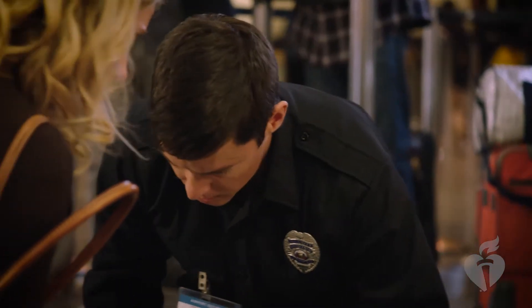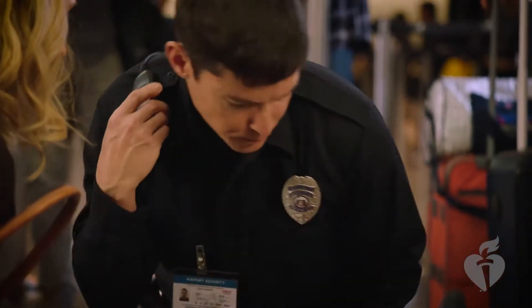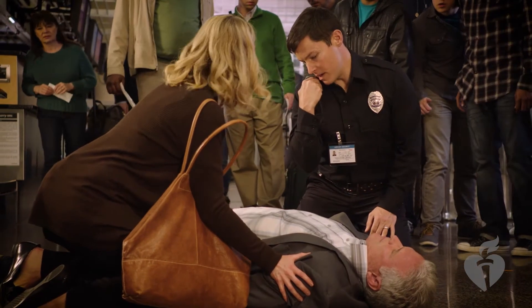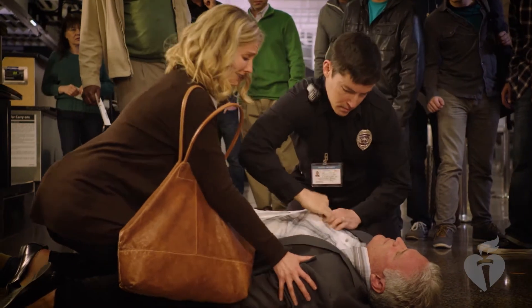He was just on his phone and then he fell over. I don't know what happened. Possible cardiac arrest, medical assistance needed. What?